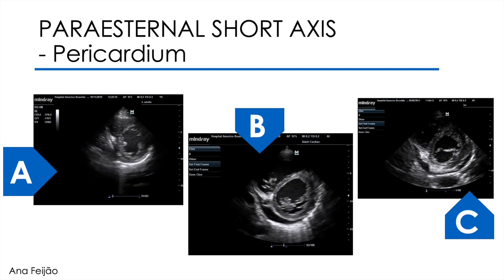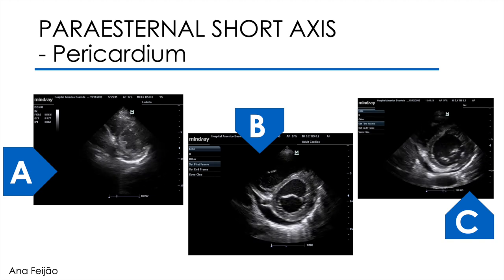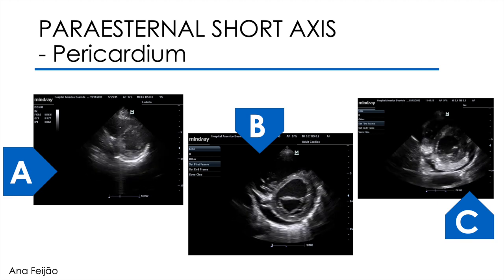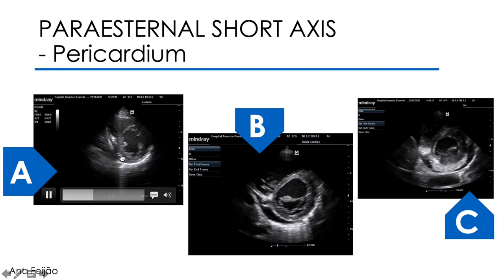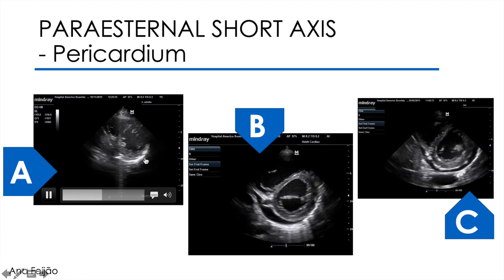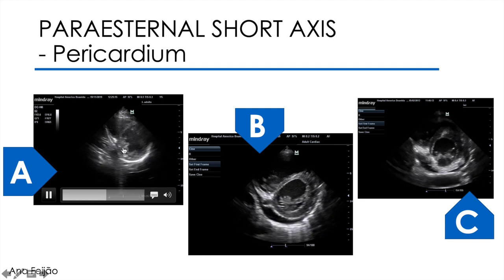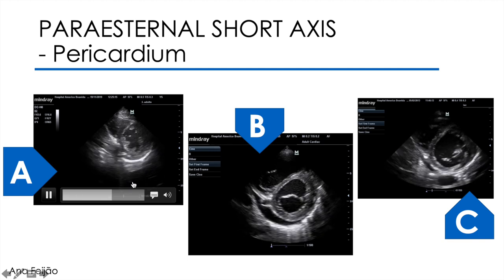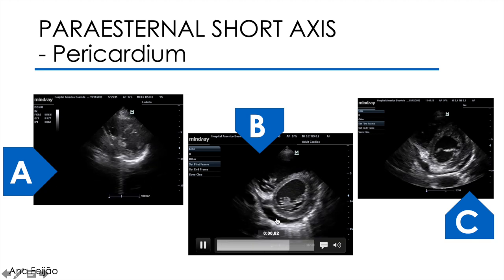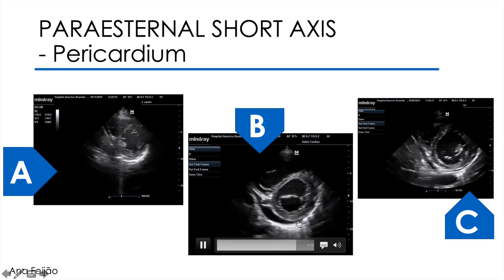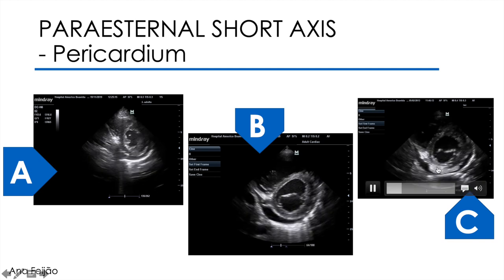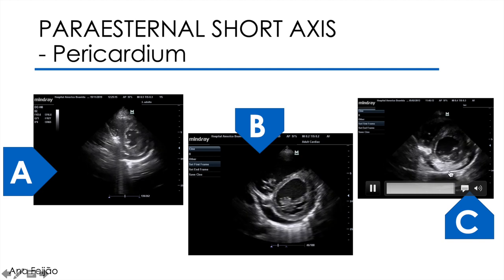Finally, it is an incidence that, by sweeping the entire heart, allows us to have an idea of pericardial alterations in all their extension. In the first example, we can see a mild lateral posterior effusion — this more echogenic zone is the pericardium, here the myocardium, and between them this anechoic zone represents the pericardial effusion. In the central example, we have a slightly larger effusion. And here in C, we can see these echogenic filaments inside the effusion which correspond to fibrin, suggesting an old and organized effusion.